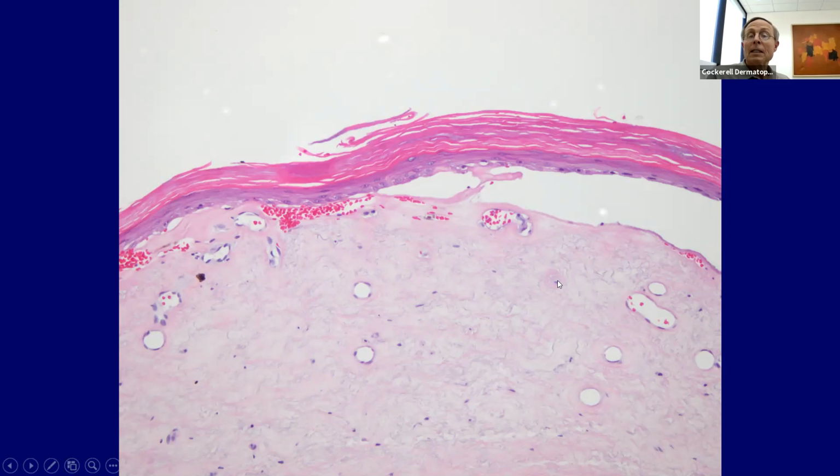You can get bullous lichen sclerosus et atrophicus. This has some red cells in it, so it's not just an artifact. It's a real blister. So it really and truly gets vesicular in these patients a lot of times with a markedly thinned epidermis. So thin epidermis. You can still get a pretty thick cornified layer when your epidermis has only got 2 cells in it.